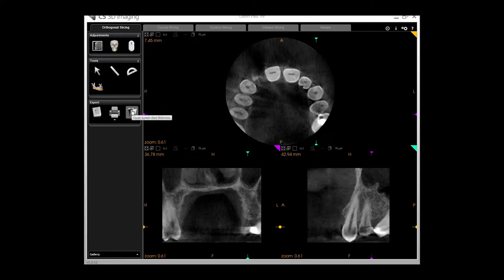The top aspect of the tools involves brightness and various aspects. The middle involves measuring aspects, and the lower is to do with exporting and printing. You can play with that and have a look, but first we'll look at the orthogonal tabs.